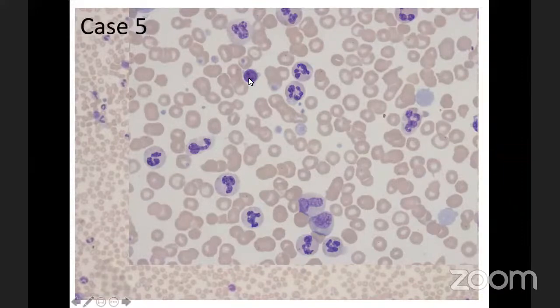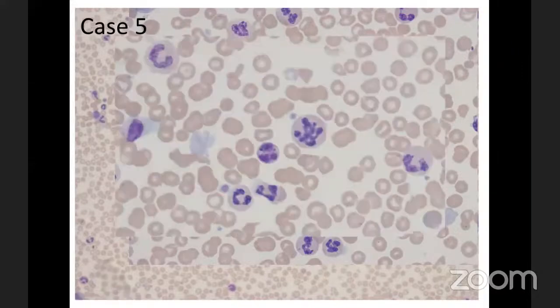We have a lymphocyte here, and a good number of platelets with giant forms, or anisocytosis, with variability in granulation. We have hypersegmented neutrophils, and we have a basophil, but we don't have basophilia, and we don't have monocytosis. Mainly a granulocytic leukoerythroblastic blood picture.